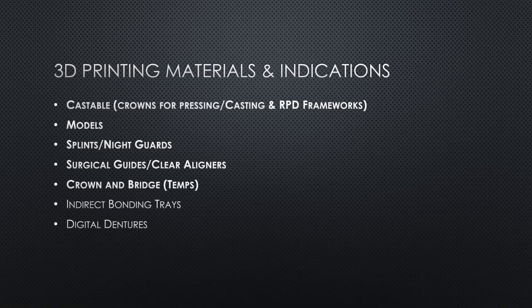So you can imagine the scope and magnitude of models that Invisalign needs to produce. And to this day, they are by a wide margin the largest producer of 3D printed parts. So not just in dental, but the largest general producer of 3D printed parts in the whole world. And they're printing an average of about 325,000 models per day. So just imagine the scale of how massive an amount of models that is.